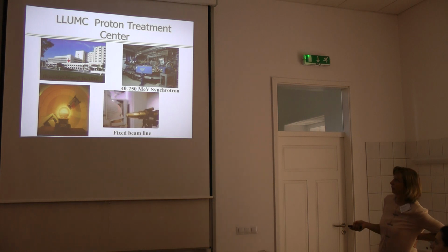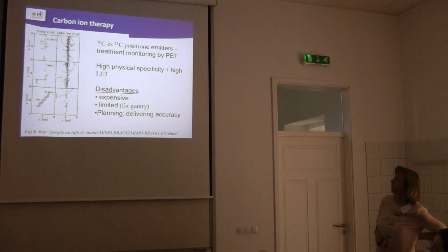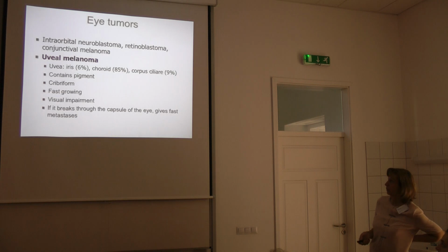And the number of centers is growing both in Europe and in Asia and in America. And the carbon ion therapy centers as well have treated already more than 10,000 patients.